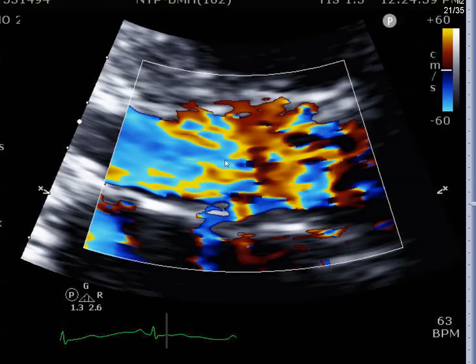So whenever you see this yellowish mixed in with a bluish color, that just means there's crazy flow going in all different directions, aliasing and being totally turbulent. I always think of traffic going through the Midtown Tunnel during rush hour. It won't be really fast, but it'll be super crowded and very chaotic.